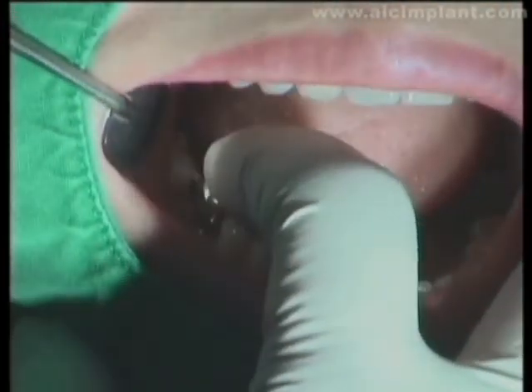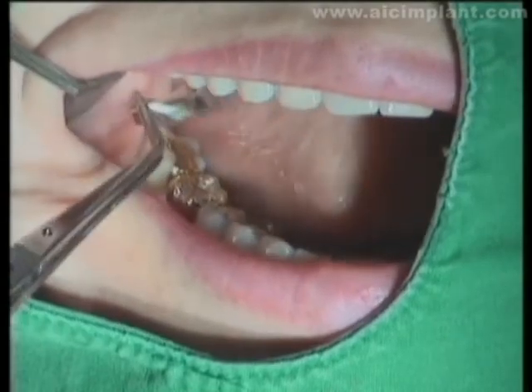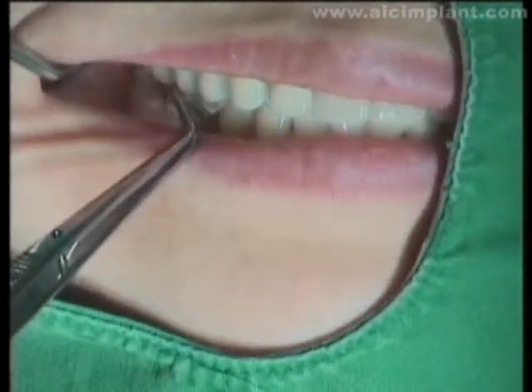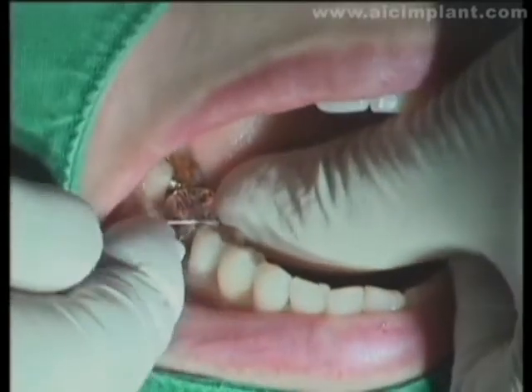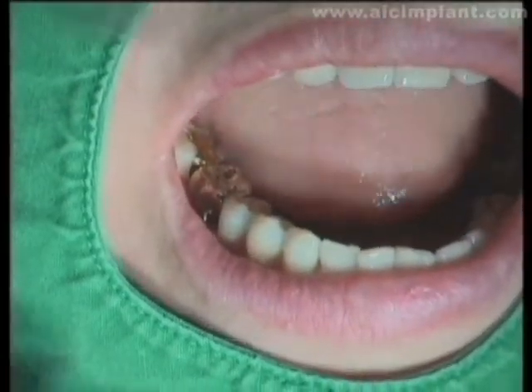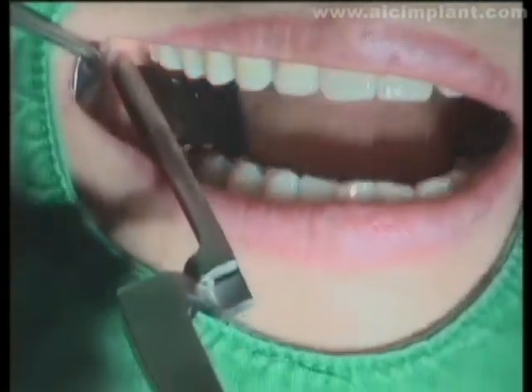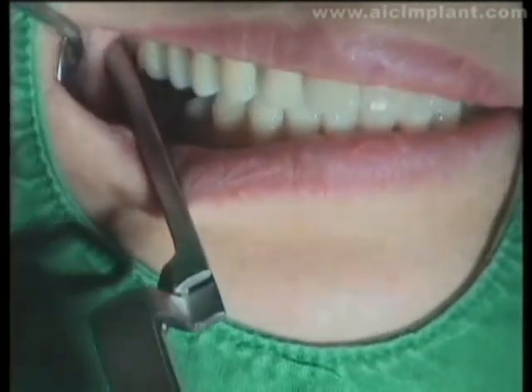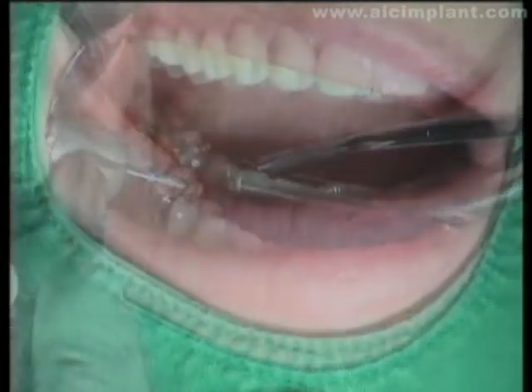Occlusal adjustment is carried out after this process. Adjust the occlusion so that natural teeth have stronger contact.